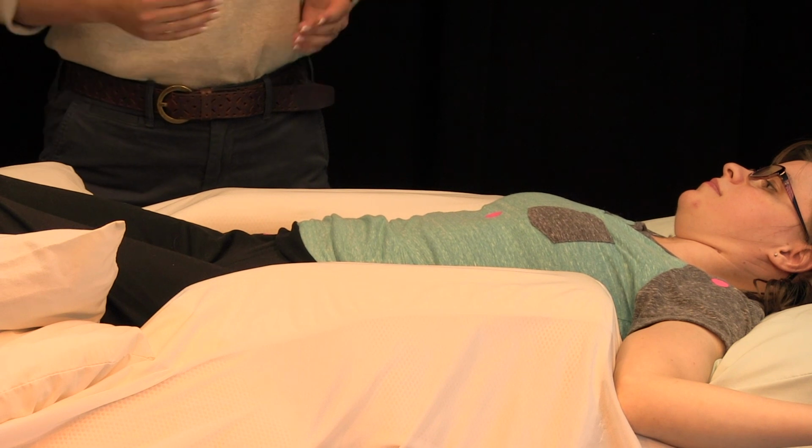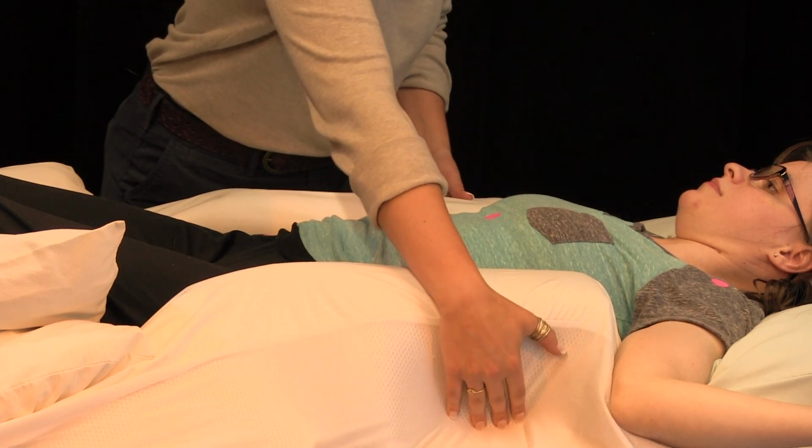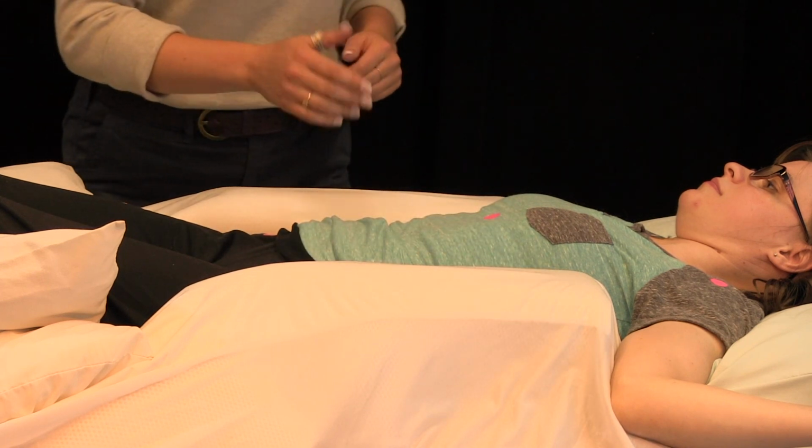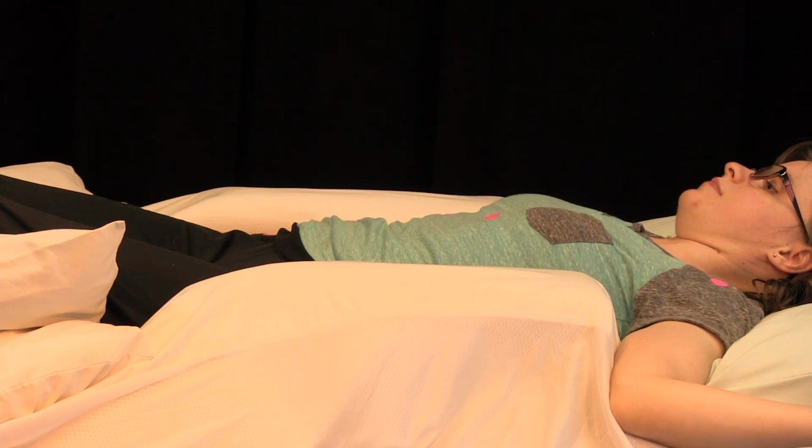This can help rotate the chest into alignment and provide support against the side of the body to help with scoliosis. So let me see here how our alignment is.